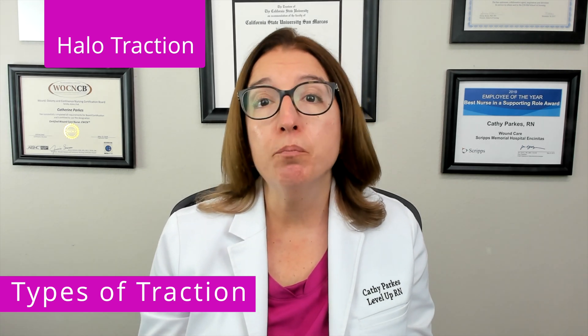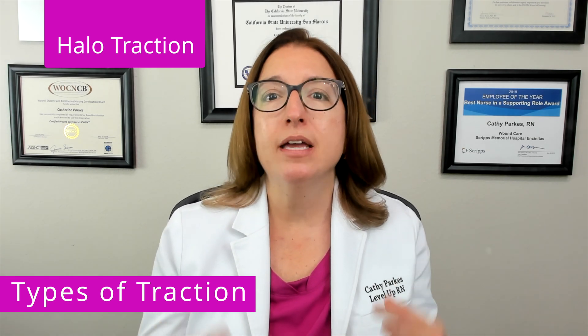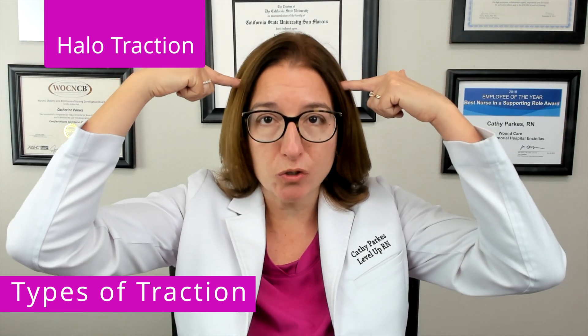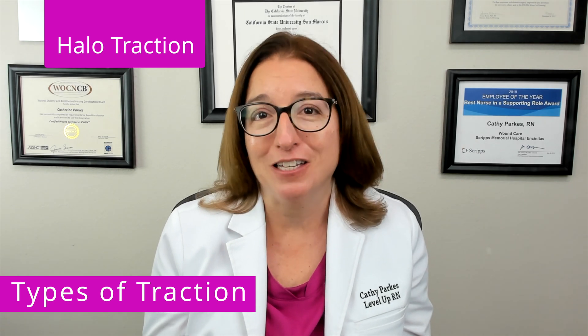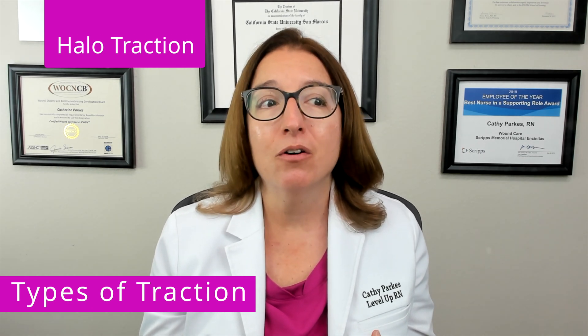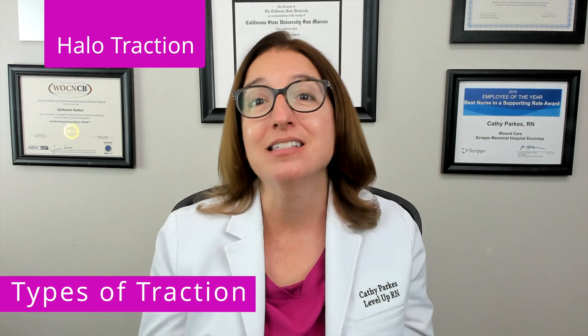Halo traction is used for cervical bone fractures as well as other disorders. With this type of traction, we have a metal ring or halo that is attached to the skull using pins or screws. If you look in your textbook for a picture of halo traction, you will see a very unhappy person, and that is legit. I have cared for a number of patients with halo traction, and they are quite justifiably not having a good time while that halo traction is in place.